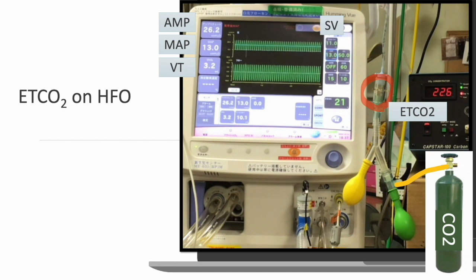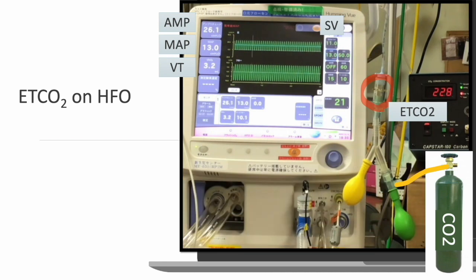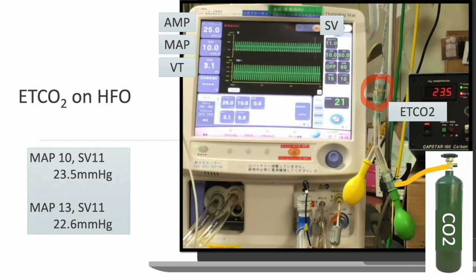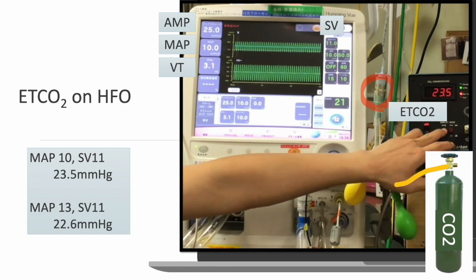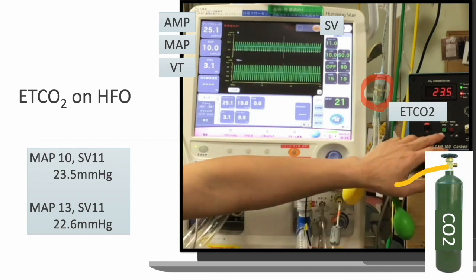At MAP 10, with a stroke volume of 11, the CO2 value was around 23.5. Later, when the MAP was set to 13, the CO2 value dropped to around 22.6, although the stroke volume setting was not changed.